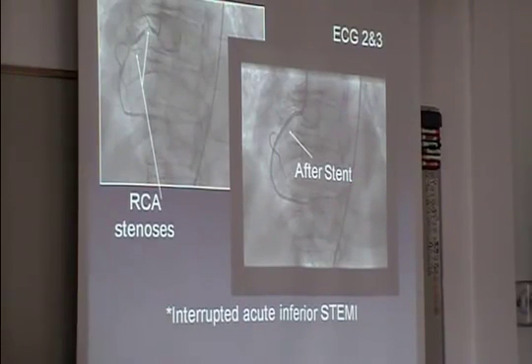But anyway, sometimes this stuttering ST elevation up and down, it can be because there's intermittently some flow, depending on nitro drip, a little heparin, whatever. You get some flow going down through the STs, they calm down. Patient still needs to be treated.